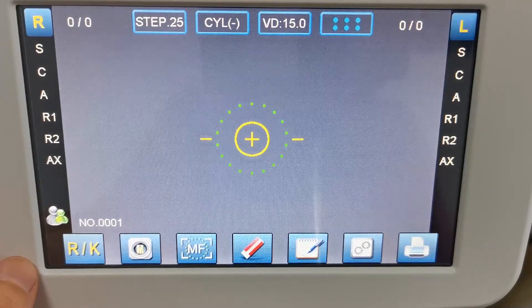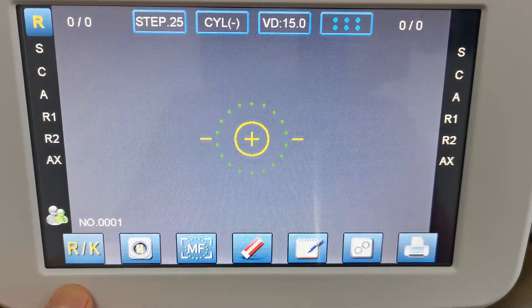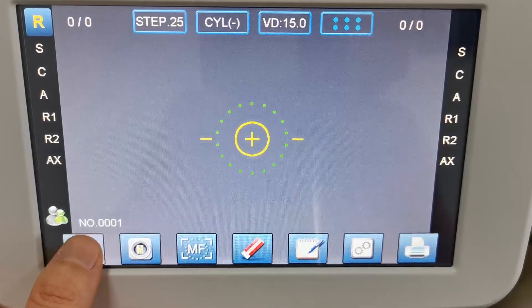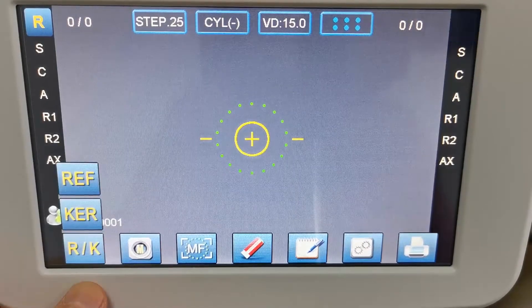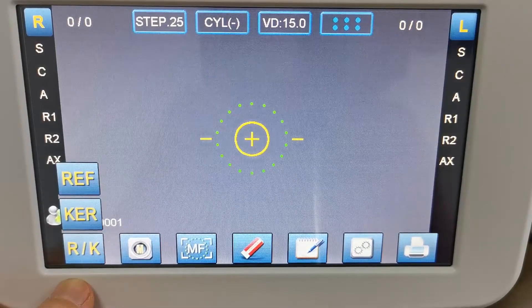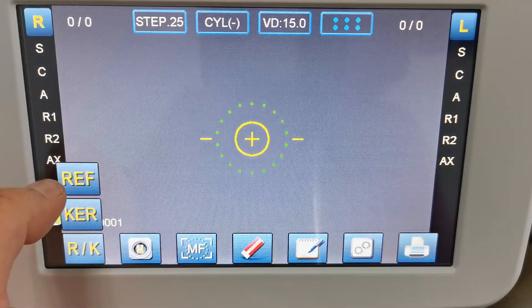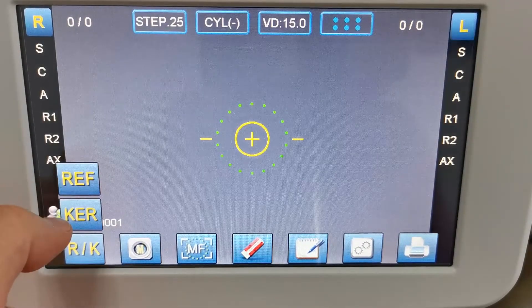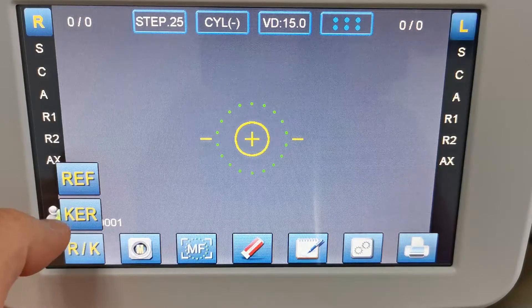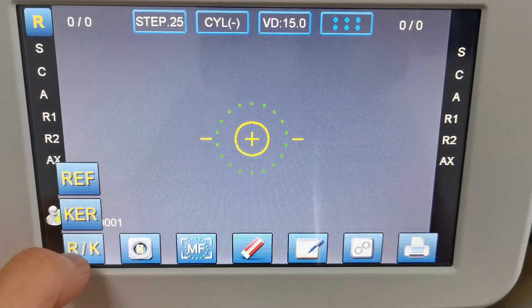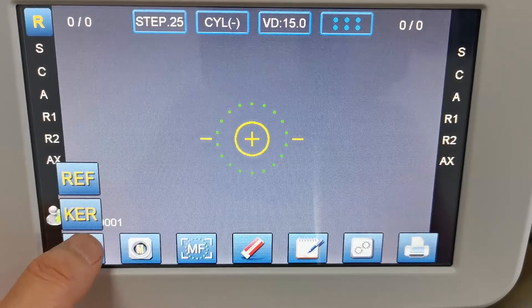And then the main menu here — the first button is to switch between refractor measurement, keratometer measurement, or both measurements together mode.